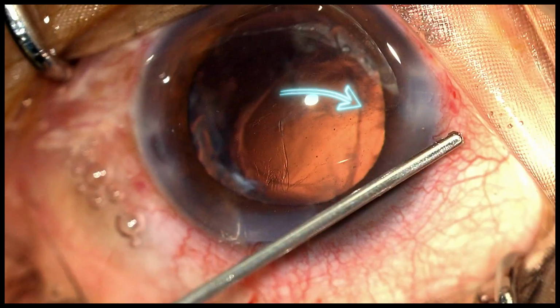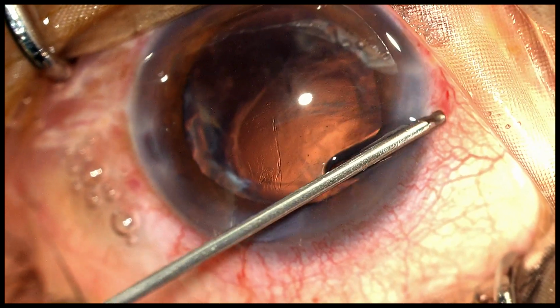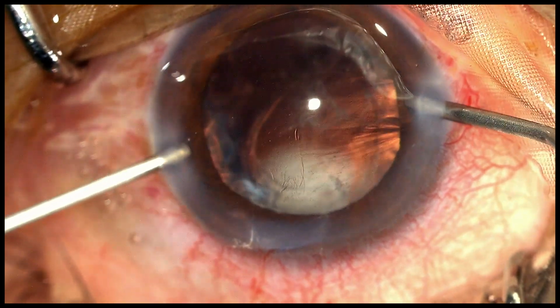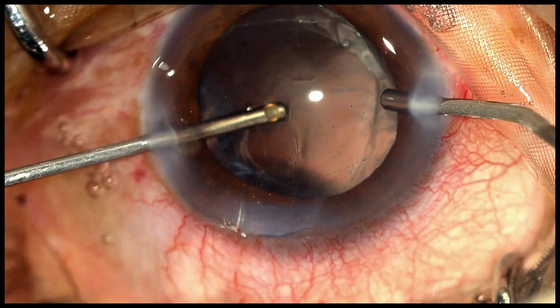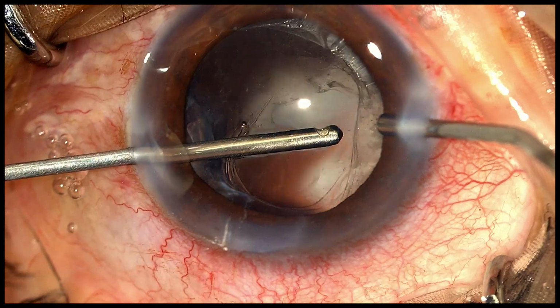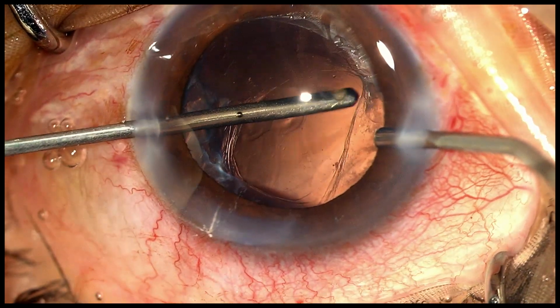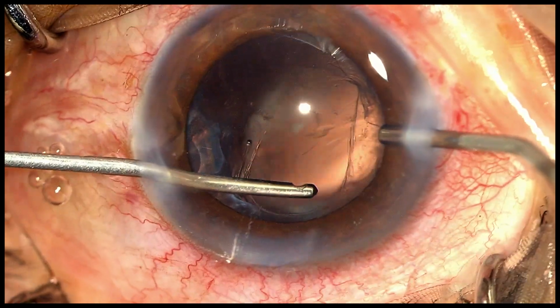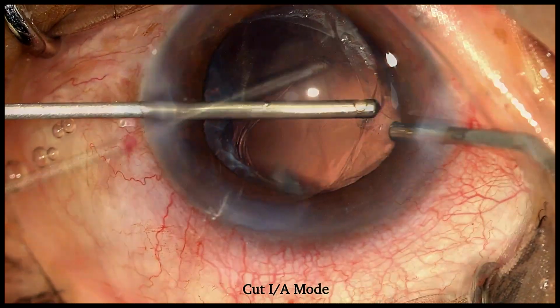There seems to be a vitreous prolapse towards the right paracentesis incision. Note at the outset, we cut the strand of vitreous that's prolapsed outside the eye. Next, with the irrigation introduced through the right side port incision, the vitrectomy cutter is introduced into the anterior chamber and starts to cut the vitreous, initially from within the wound and then from the anterior chamber and finally in the area of the posterior capsular rupture. This cutting of the vitreous is done in the cut IA mode.